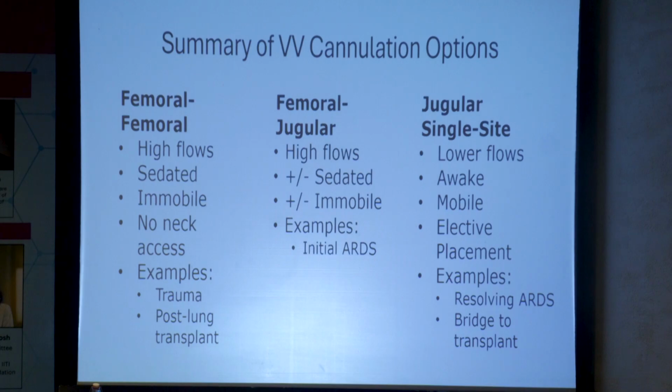And that becomes challenging. So ARDS is never an elective diagnosis or an elective procedure, but you can have somebody who is relatively stable ARDS, who you can transport safely to the operating room or the radiology suite, and you can have the patient who is suffering from cardiac arrest or near cardiac arrest or severe hypoxemia where you don't have that option safely at all. So that elective is in quotation marks.